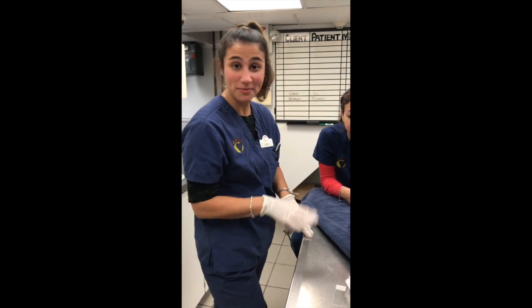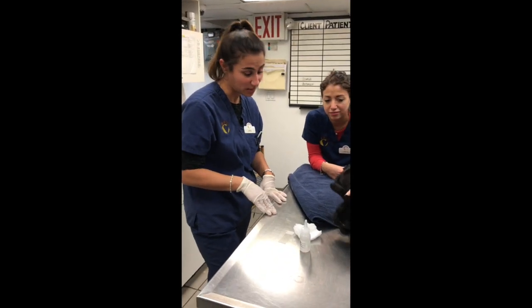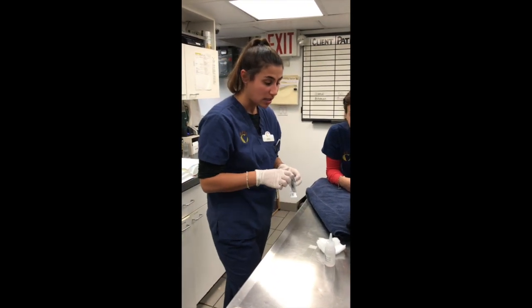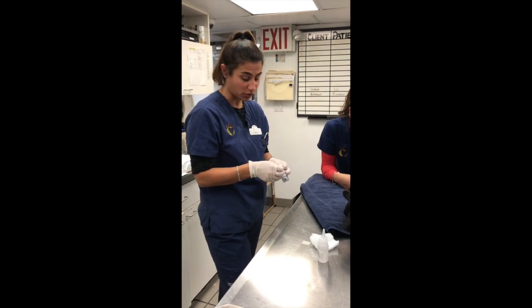Okay, so today we have Mr. McQueen with us, who's actually Victoria's kitty. We're going to be doing a skin cytology on him. We do suspect that he might have some sort of external parasites, maybe some surface mites. Nothing like sarcoptic mange, so I'm just doing a surface scraping. I'm not doing a deep scraping.